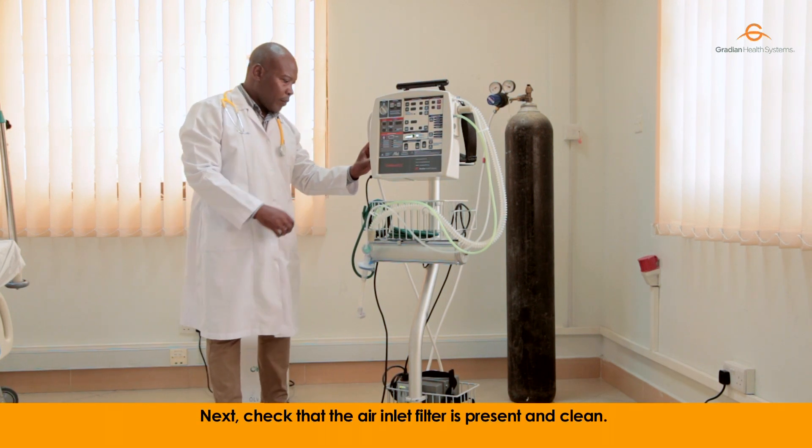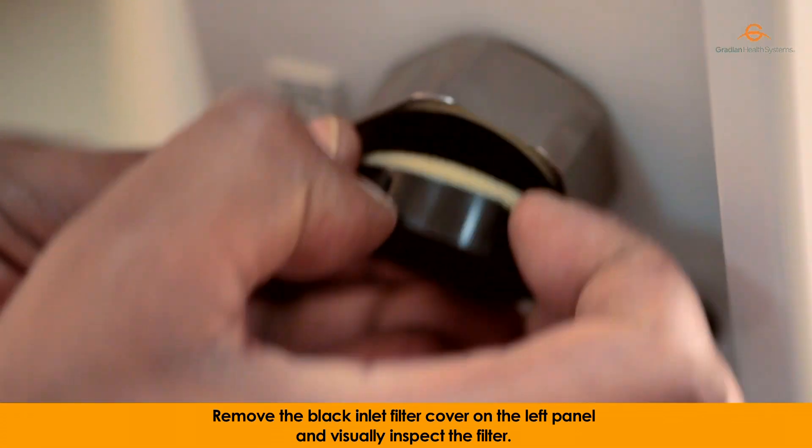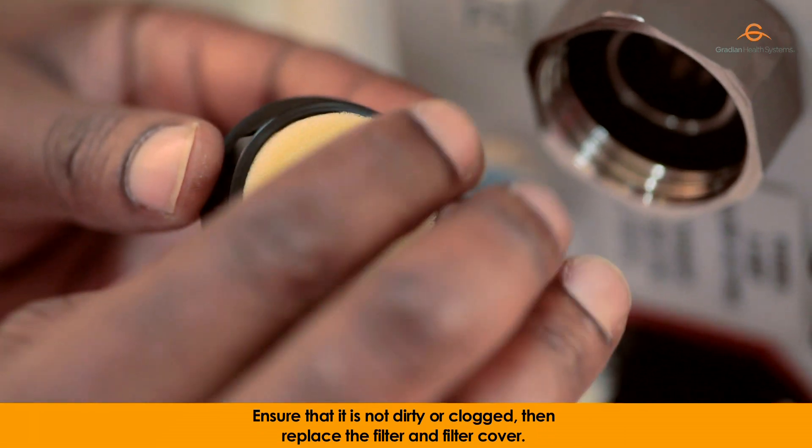Next, check that the air inlet filter is present and clean. Remove the back inlet filter cover on the left panel and visually inspect the filter. Ensure that it is not dirty or clogged, then replace the filter and filter cover.